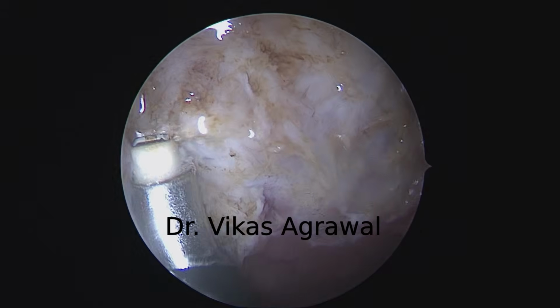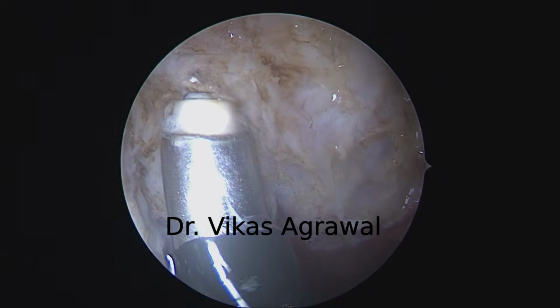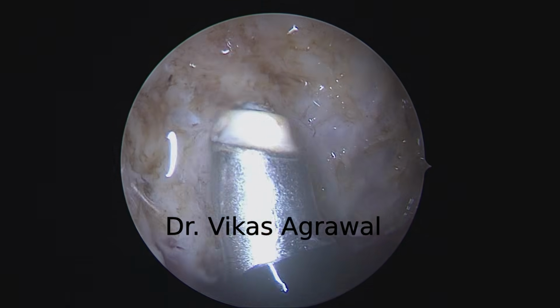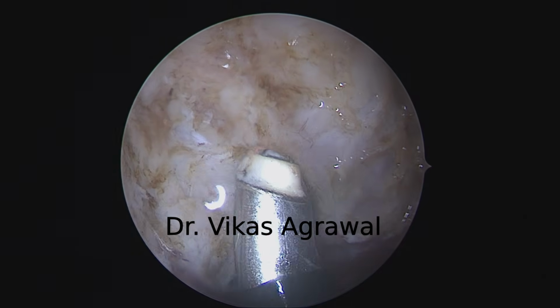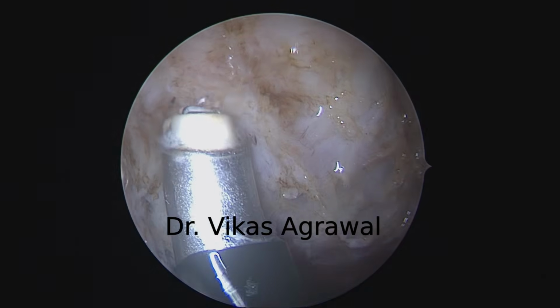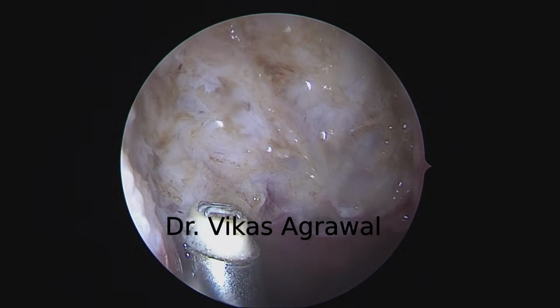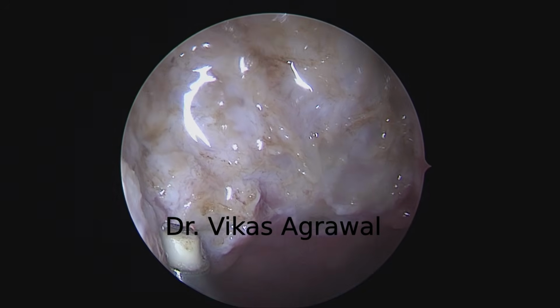So, was it a recurrence? No, it was a residual adenoid. If you remove the adenoids completely, they do not recur. It is the residual adenoid. Can you see the fascia very clearly? I have not opened up the fascia. I have just reached the fascia and defined it.